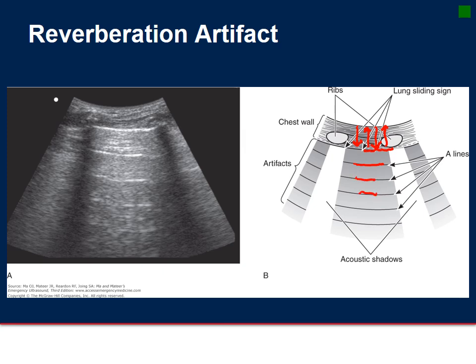and so on. And so with lung imaging, for example, this is the pleura in between 2 ribs, and we see that because of reverberation artifact, we see these lines coming down our field. And those lines, of course, are not real, and they're just because of a reverberation artifact off of the pleura. We also see another artifact in this image that we talked about previously. These are acoustic shadows because of the ribs that we're trying to ultrasound between.